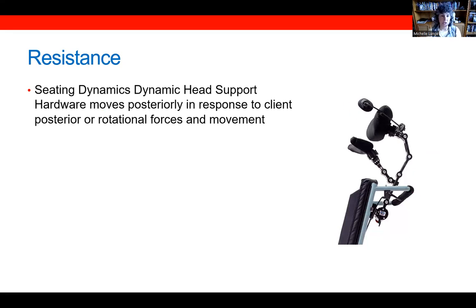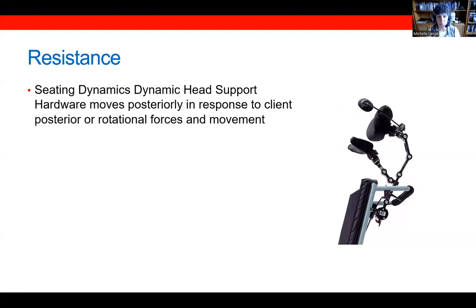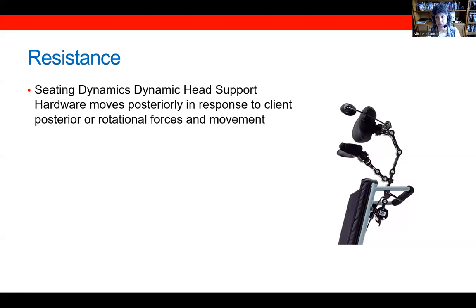So Seating Dynamics dynamic head support hardware moves posteriorly in response to client either posterior force or rotational force or a combination of the two.